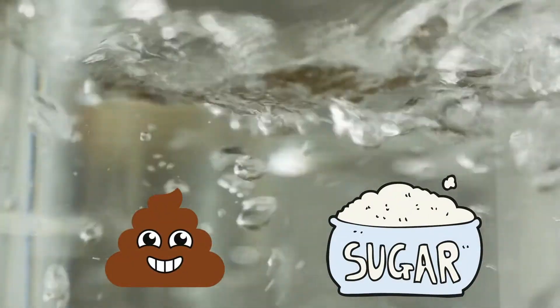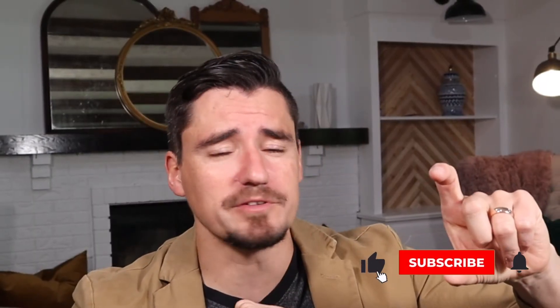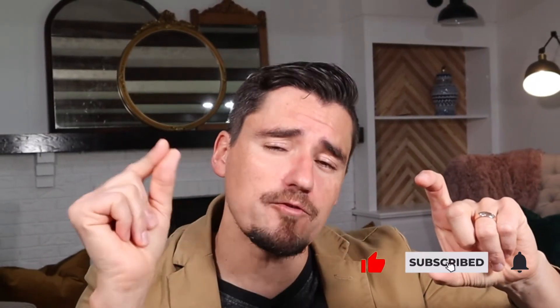What we're going to do is take that poop sample and put it in a container with sugar water. We're going to mix it up a little bit, make a beautiful little slurry, and then take a cover slip off a microscope slide and put it on top. We let it sit for five to ten minutes, and then as the eggs rise to the surface in the sugar water — because they are less dense — they come in contact with the microscope slide cover, and the eggs and the sugar water residue all sit on that.